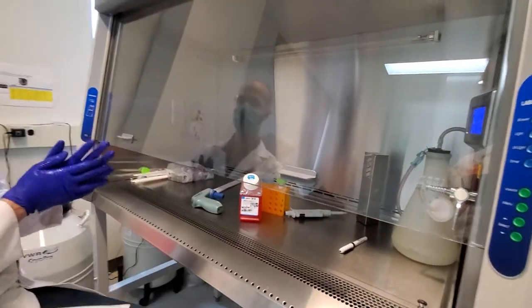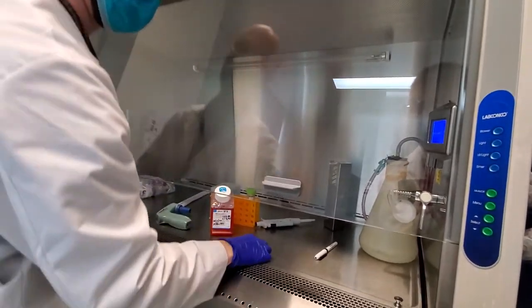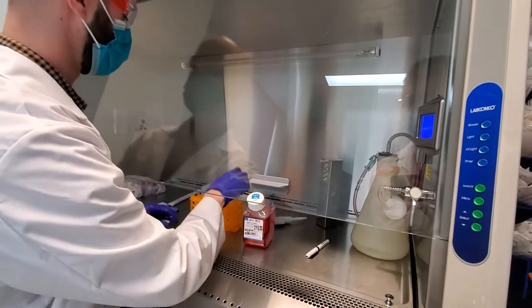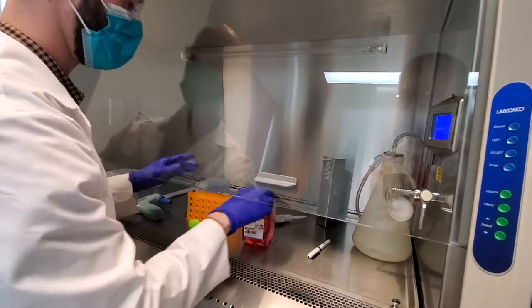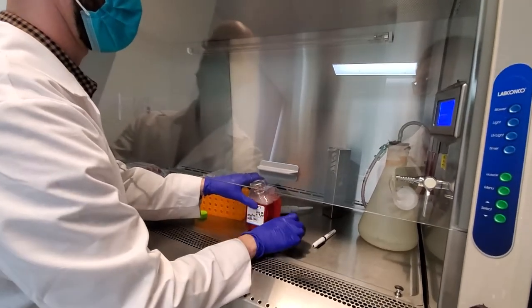Prepping out how much media I'm going to use for that. There's a lot of different ways you can do the thaw. But basically the cells are frozen in media plus DMSO. And the DMSO is the cryoprotectant. It prevents the cells from bursting. But it's also toxic.